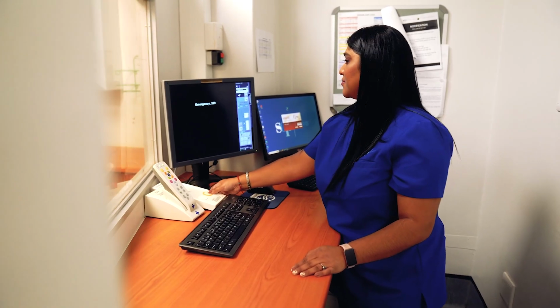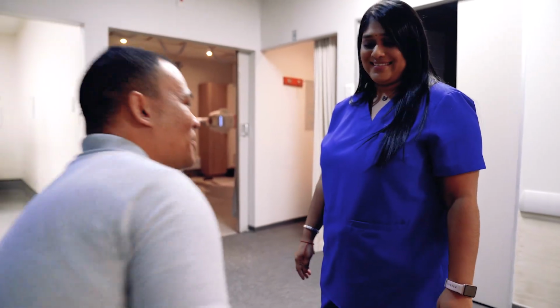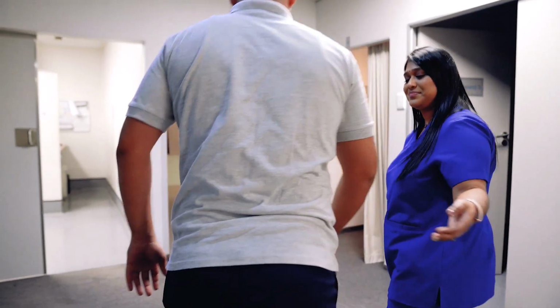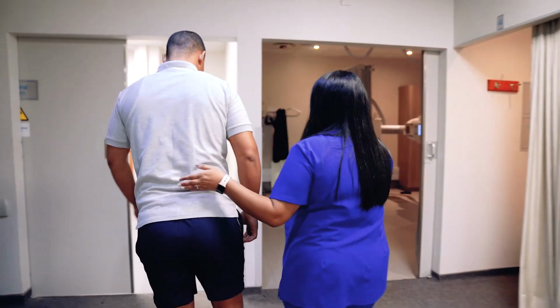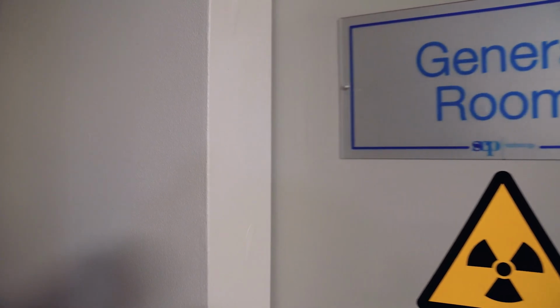When you arrive at the department, we will ask you to change into a gown if necessary, and also depending on the severity of your injury. We will then take you through and receive signed consent. Thereafter, you will go to the specific exam that the referring doctor requested for you, be it an X-ray or CT or an MRI. We will go through questions, should it be relevant.